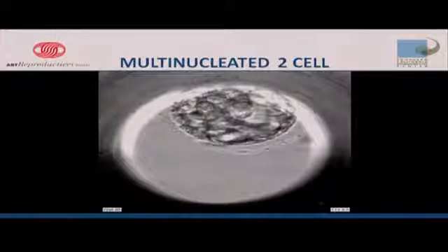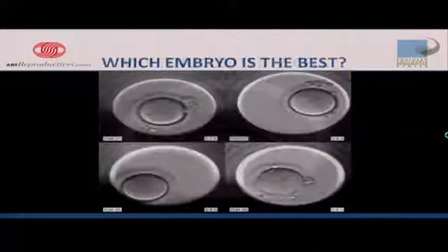But that did form a blastocyst. Yes, once again, not the most perfect one, but we're always ranking them in the best situations, and this tells us something that would eliminate that one from being transferred, or at least wouldn't put it in the top tier of embryos to be transferred. So something else we look at that we would never see any other way.